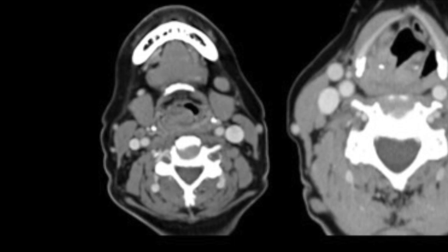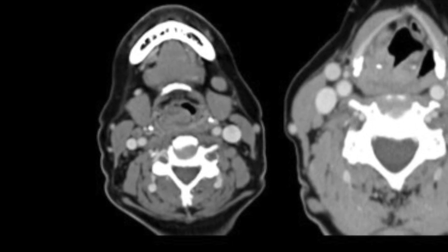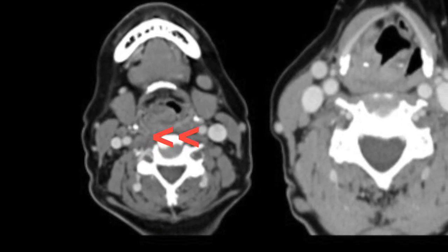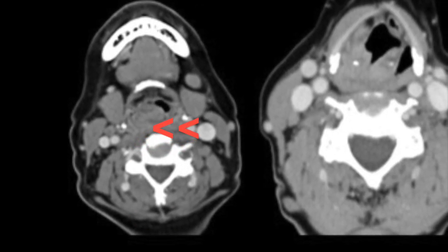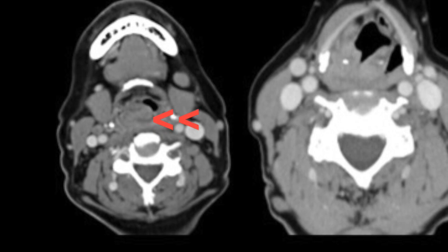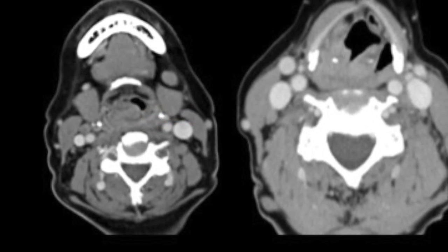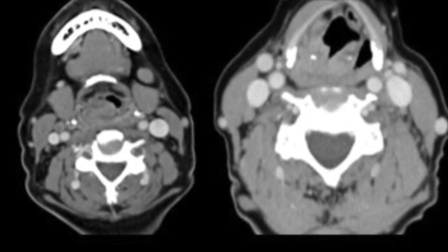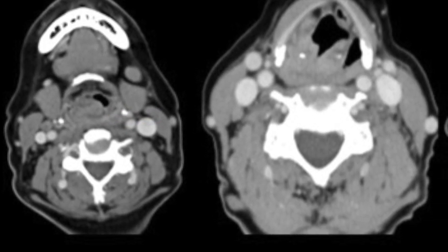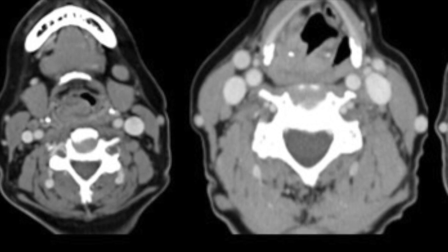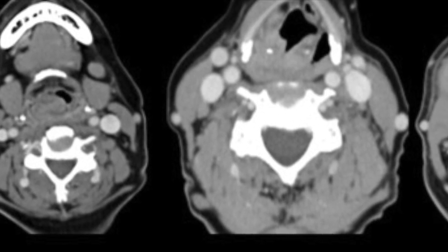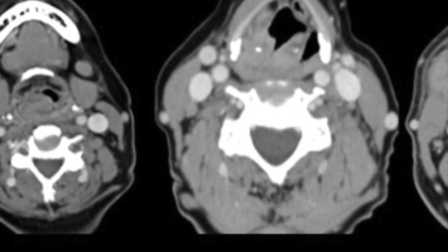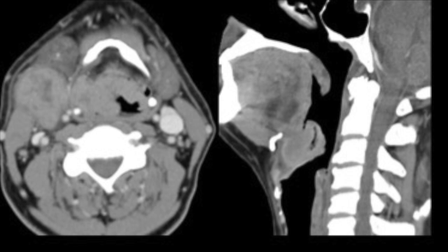In the first figure, we can see a small-volume right aryepiglottic fold lesion without any invasion of the pre-epiglottic space — this is an early T1 malignancy. In the next figure, we can see minimal invasion of the pre-epiglottic space, which is T2 disease.